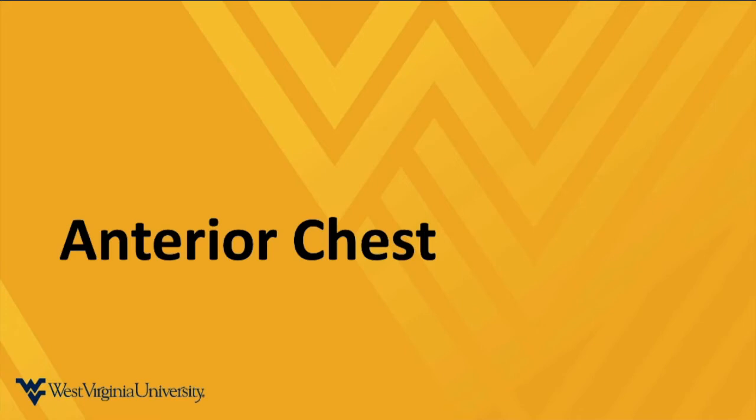Well, so far, we've talked a little bit about just the basic approach to the exam, and we've gone through some cases. We've looked at a quick demonstration of a normal exam. Next, we're going to talk through just the different structures that we'll look at, and what the normal and abnormal findings are going to look like. The first of that is going to be the anterior chest.